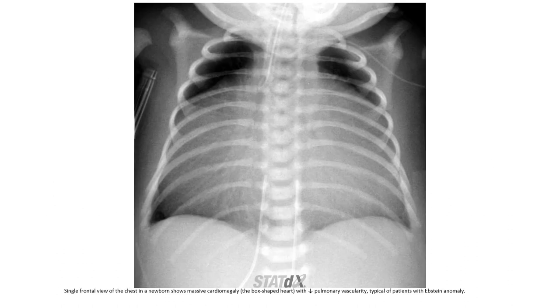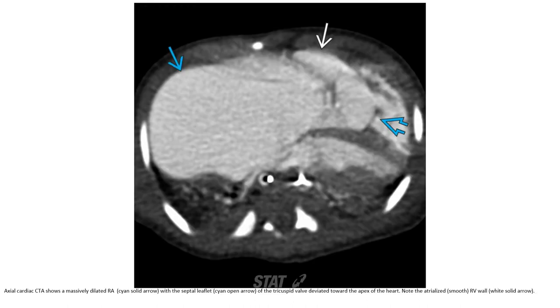Single frontal chest radiograph in a newborn demonstrates massive cardiomegaly with decreased pulmonary vascularity, which is typical of Ebstein's anomaly. Axial cardiac CTA shows a massively dilated right atrium with the septal leaflet of the tricuspid valve displaced towards the apex of the heart. Note the atrialized right ventricle on the lateral wall.